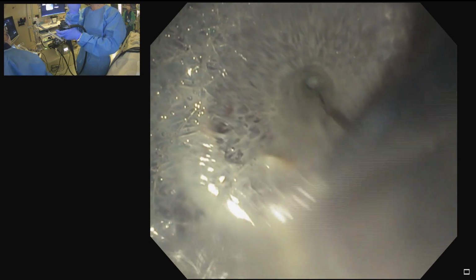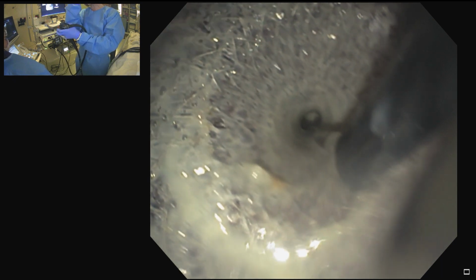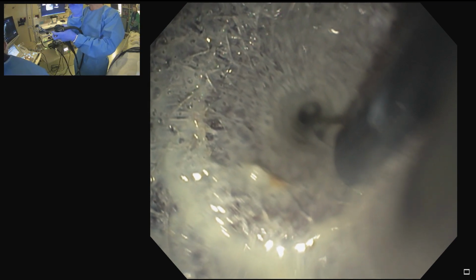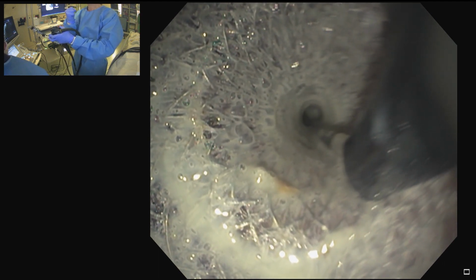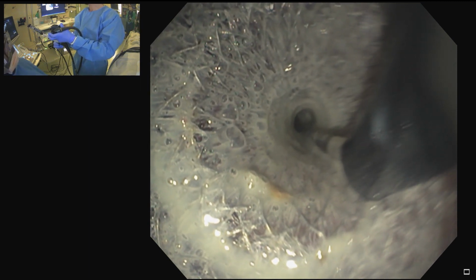All right, now this is the next tip I want to share with you. Be very careful when you pull out the ceramic tip. This is the cable. You see the cable, and it's a very narrow lumen right now. We're going to dilate the saddle in a moment, but right now there is a risk that if you forcefully pull back, you may dislodge the LAMS. So you want to do that under direct visualization.